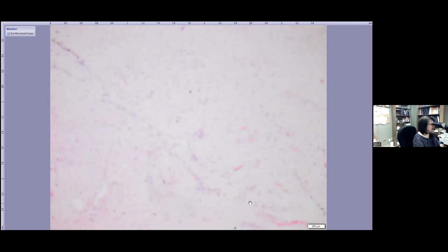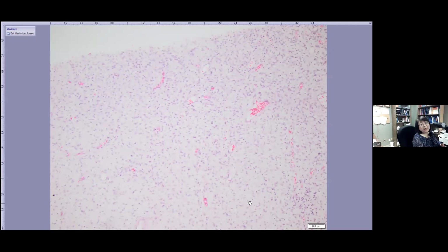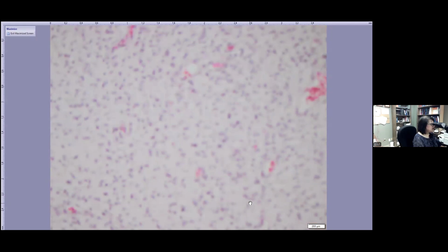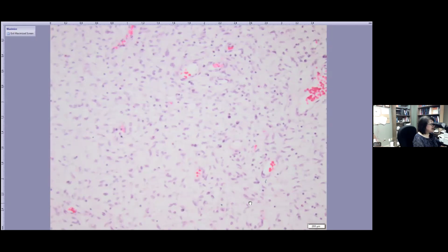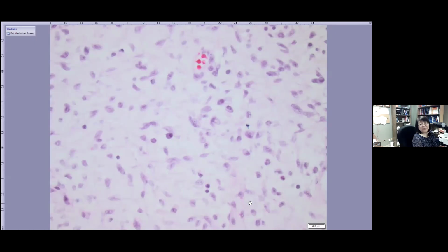It's a young child, a 3-year-old, with a deep dermis, big mass, with more cellular areas, myofibroblastic proliferation, some giant cells, some pseudocysts, and background chronic inflammation, like these plasma cells. So what's your differential? Or what immuno do you want to do?